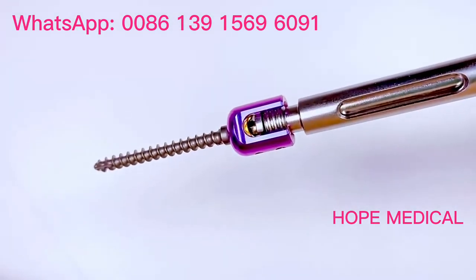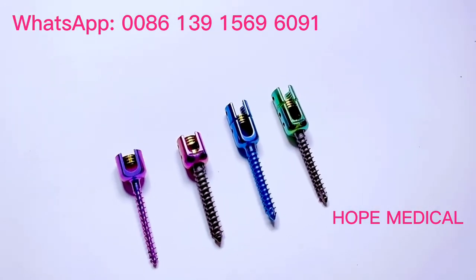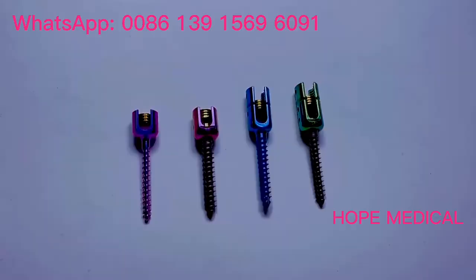All the Pedicle Screws are produced by CNC machine. Welcome to choose from us.